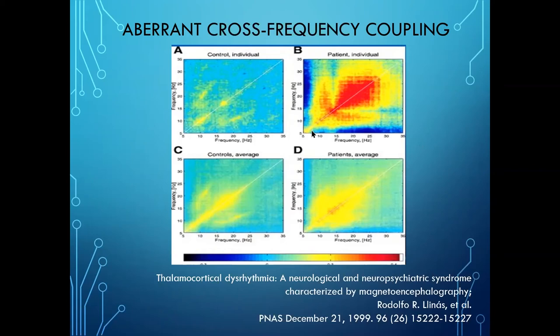But this is a Parkinson's patient. And this is one of the original studies by Rodolfo, and he identified this as a phenomenon early on. What we have is cross-frequency coupling between a slowed alpha, probably somewhere down around 6-7, and faster activity. You can see all of these frequencies are linked together, and you get this gigantic flare in the pattern. Now, behaviorally, a Parkinson's patient has neural networks that become frozen, a neural network that's been locked on. When a neural network is formed, gamma emerges as a brief burst. In certain pathologies, that gamma is persistent.